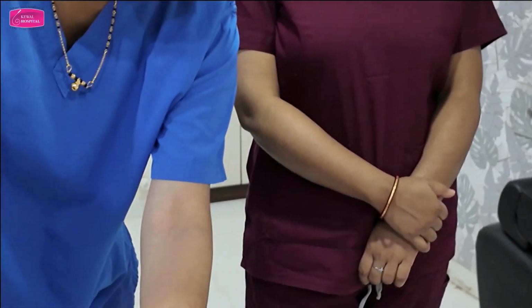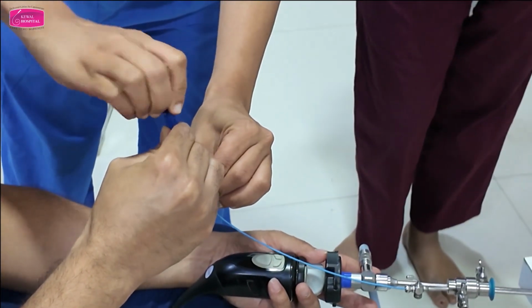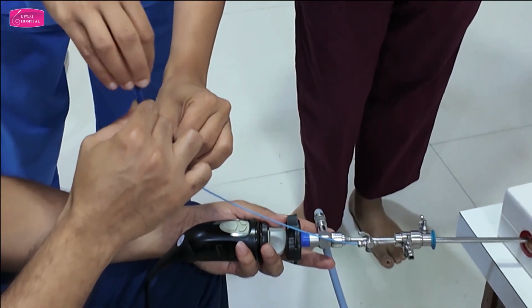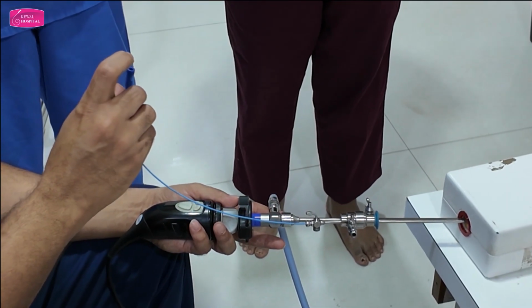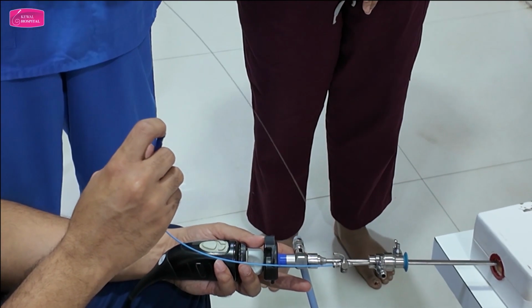There is a stilet. Anti-clockwise. Whenever you want to take out something, anti-clockwise. Remember this: clockwise it goes in. Take it out. Pull it. Understood? And then attach the syringe here and push the dye.